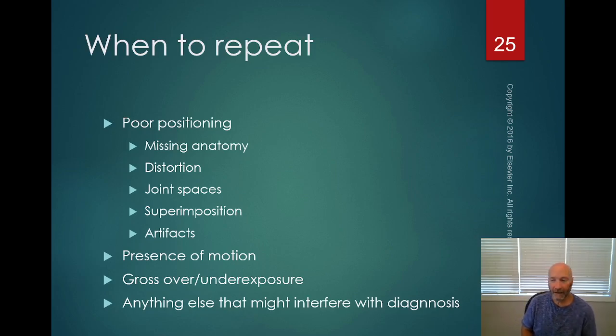So then you come to a point of when to repeat. There are times to repeat, and there are times to learn from your mistakes, take your lumps, and not repeat. So when to repeat: if you have poor positioning where you have missing anatomy that could determine whether or not the image is going to be diagnostic.